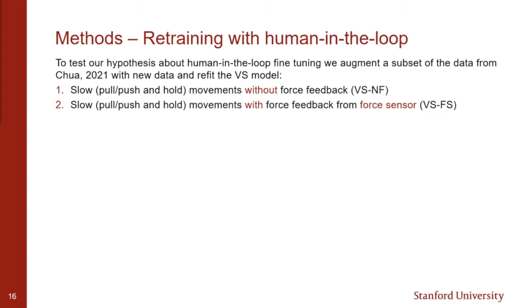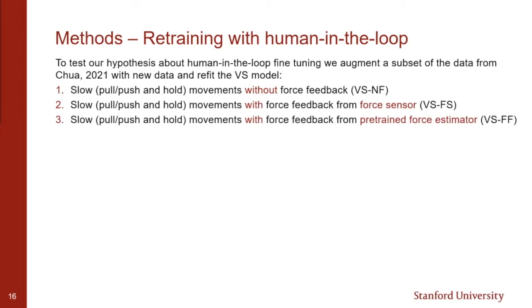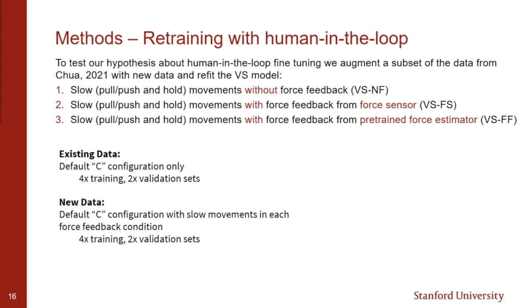And then lastly, with one of our pre-trained force estimation networks, namely the multimodal one, the VS network. And then we took only a subset of the data from our existing data set and augmented it with the new data set, such that the contribution from each would influence the training process equally.